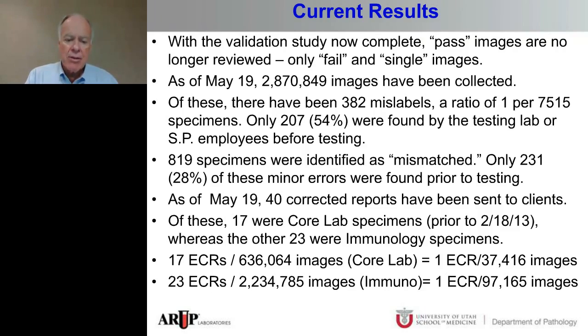It turns out that in February of 2013, we moved this system from one automated track to a different automated track. The first track delivered the specimens to our high-volume automated core laboratory where specimens are tested non-stop, 24 hours a day, 7 days a week. They test so quickly that they don't often catch the errors.